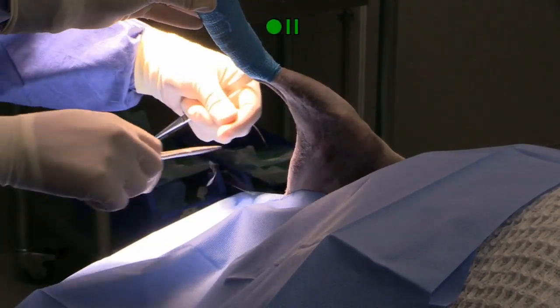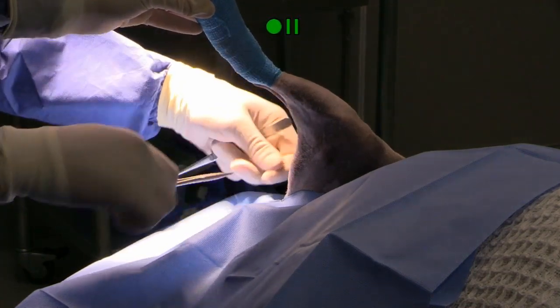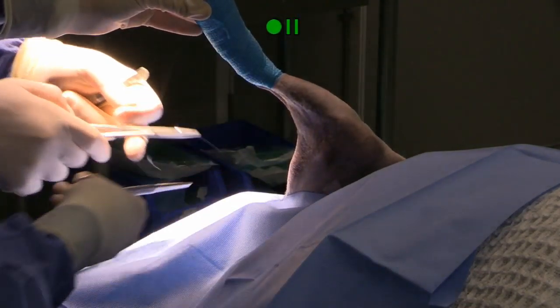So just putting the last couple of these sutures in to secure their quarter drapes, and we're going to go ahead and put on the patient drape next.